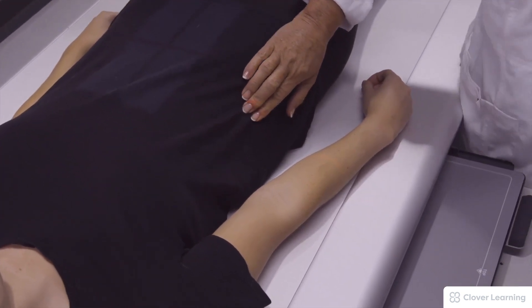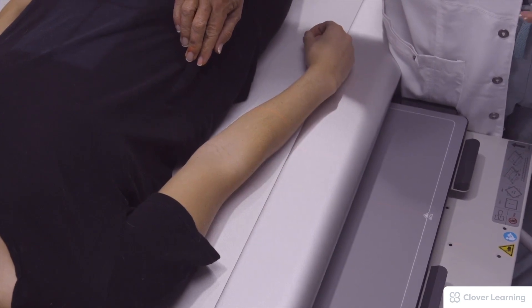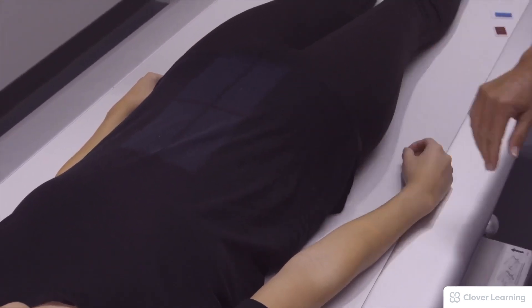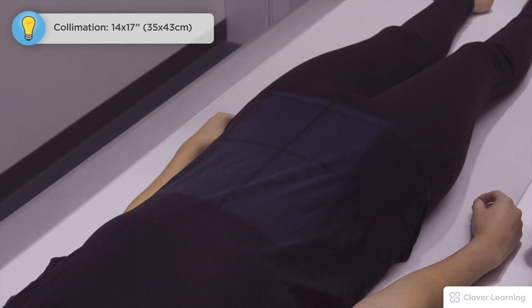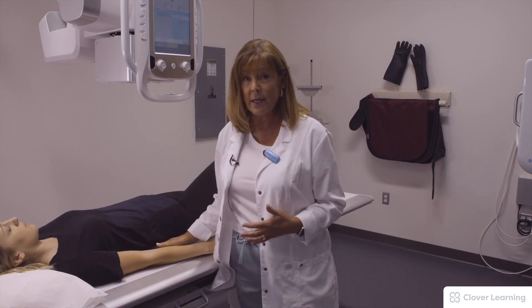It will vary from patient to patient and the IR that you use whether you center at the crest or an inch and a half above the level of the crest. You want to use the mid sagittal plane. We're going to keep that collimation open lengthwise and collimate about 2 inches from side to side.